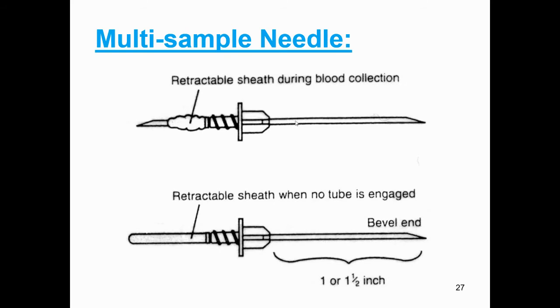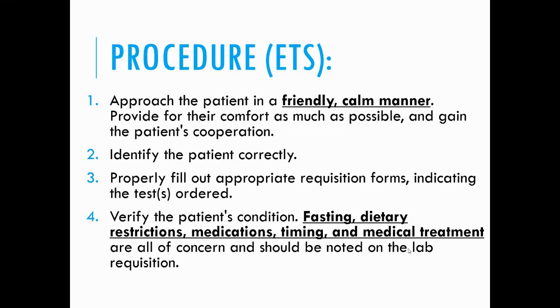So multi-sample needle, retractable sheath during blood collection, and retractable sheath when no tube is engaged. So this is your needle, 1.5 inch.